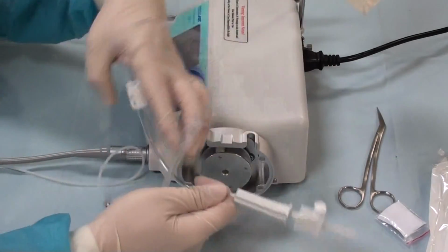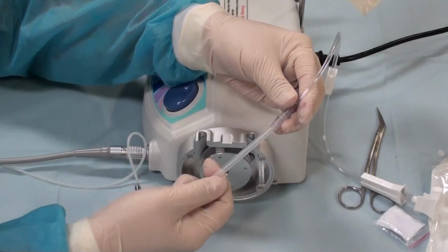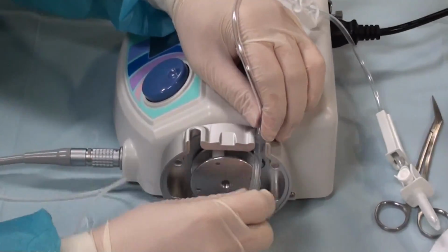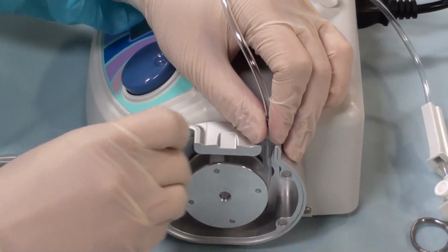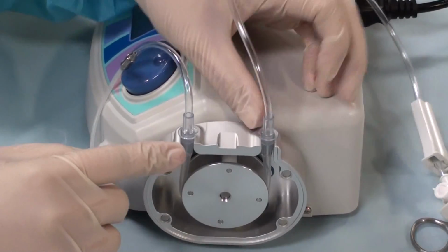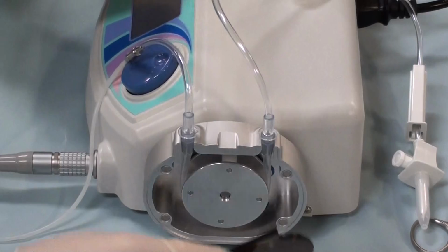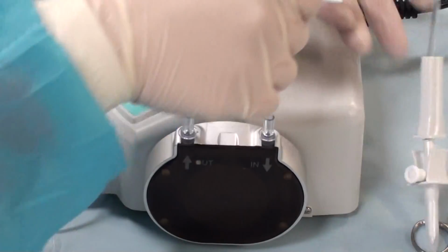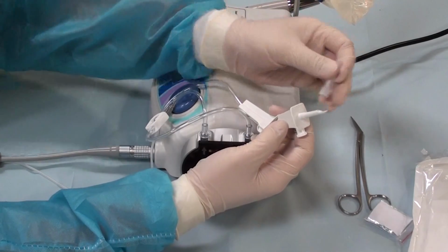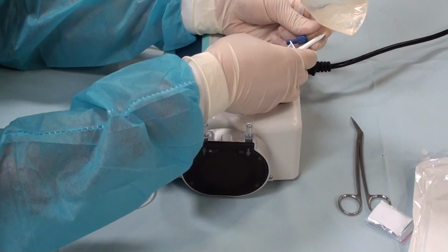And then you grab the spike end of the tube, and when you see your first plastic stopper, you want to put that into your housing, and you want to stretch the tubing under the wheel, and you want to bring it all the way around. You should see two stoppers, just going to fit very snug. And then you put your cover back on, take off the plastic cover of the spike, and insert it into your water source, and then you're good to go.